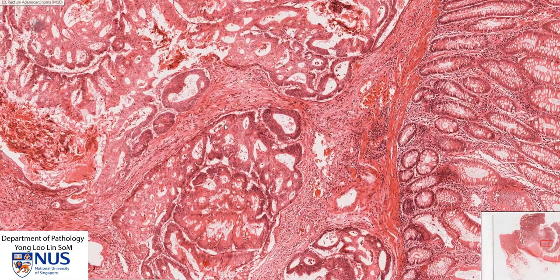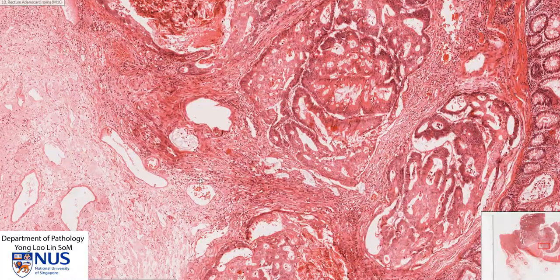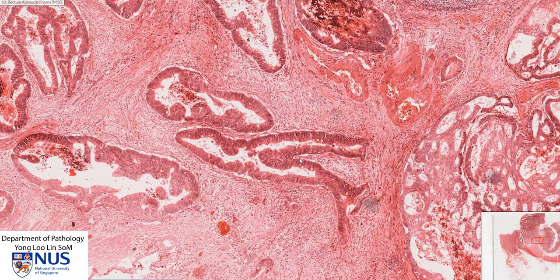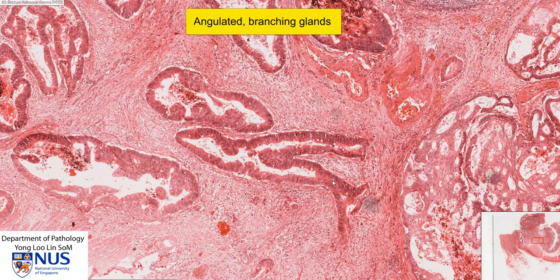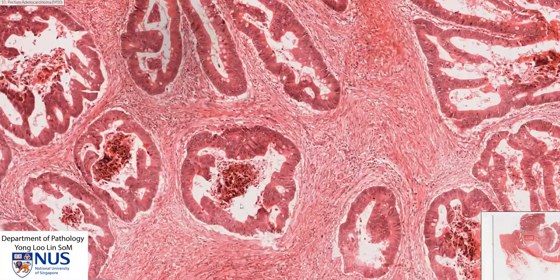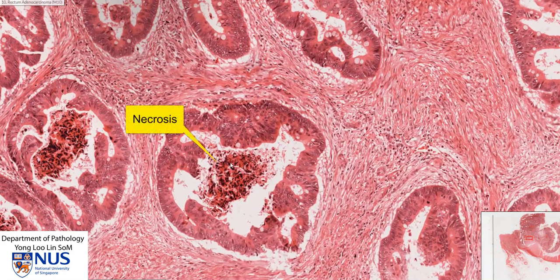We have cribriform architecture and irregular glands. Moving on to this frankly invasive area, we can see the glands are angulated and branching — they are not nice and round like the benign crypts. This is architectural atypia and complexity. In some of the neoplastic malignant glands, we can also see necrosis.